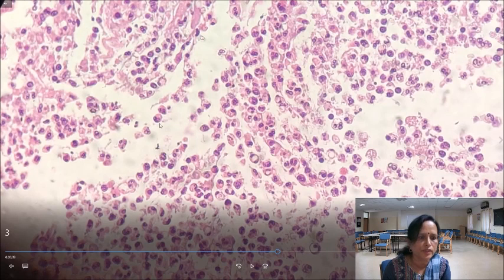All these are neutrophils. If you were not able to appreciate them earlier, now look at it. This one is so clear. This is so clear. This is nice. Whenever we see these lobated nuclei, we know they are neutrophils. See, 1, 2, 3. That's what we say ant-like.